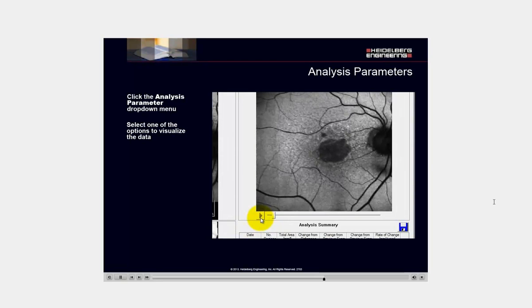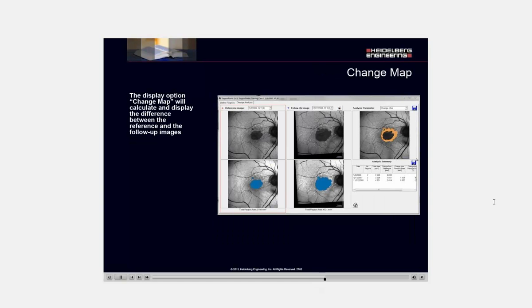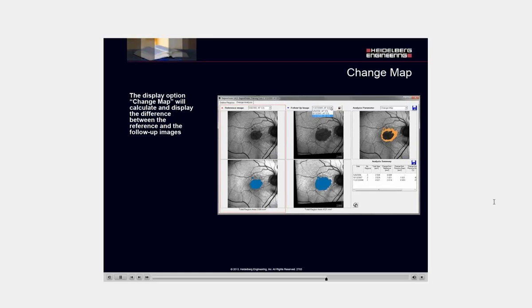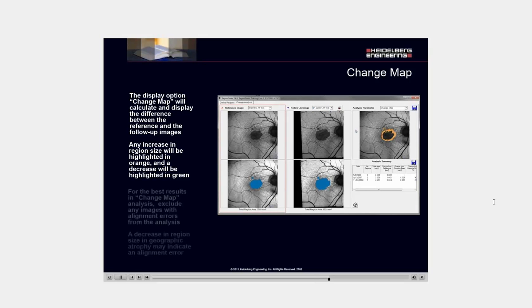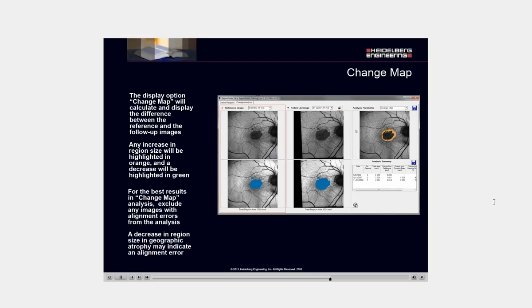The display option change map will calculate and display the difference between the reference and follow-up images. An increase in region size will be highlighted in orange and a decrease will be highlighted in green. For best results, exclude any images with alignment errors from analysis. A decrease in region size and geographic atrophy may indicate an alignment error.